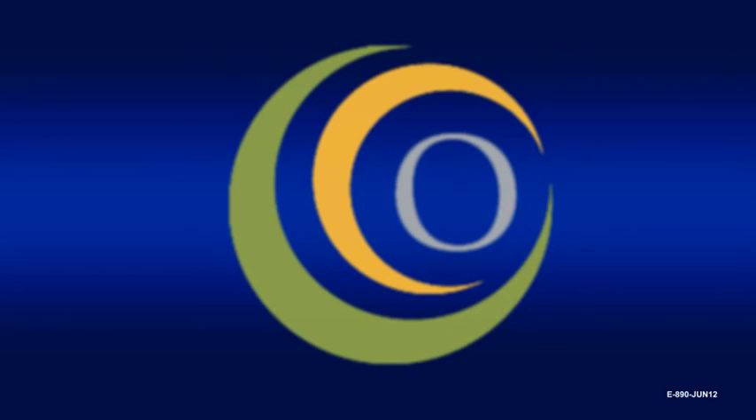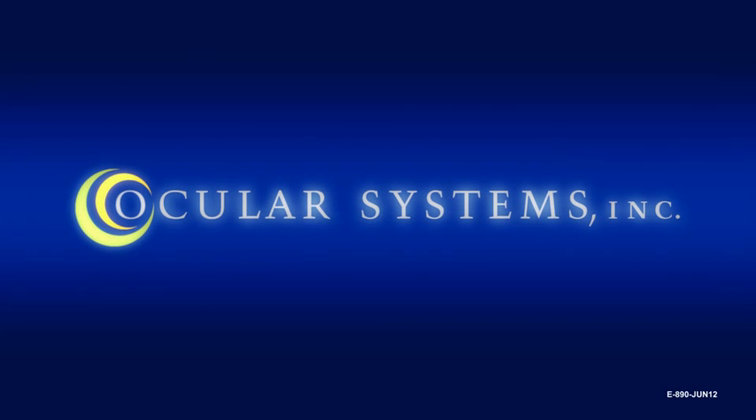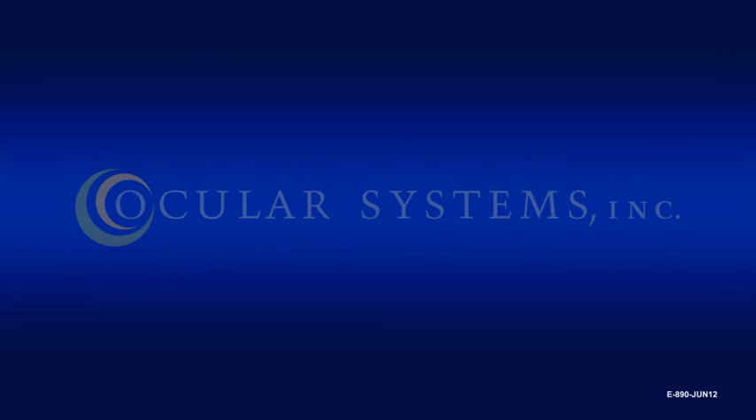Welcome to the instructional video on the use of the EndoSaver Corneal Endothelium Delivery Instrument. The EndoSaver is a device used for delivering a corneal endothelial allograft into the anterior chamber.